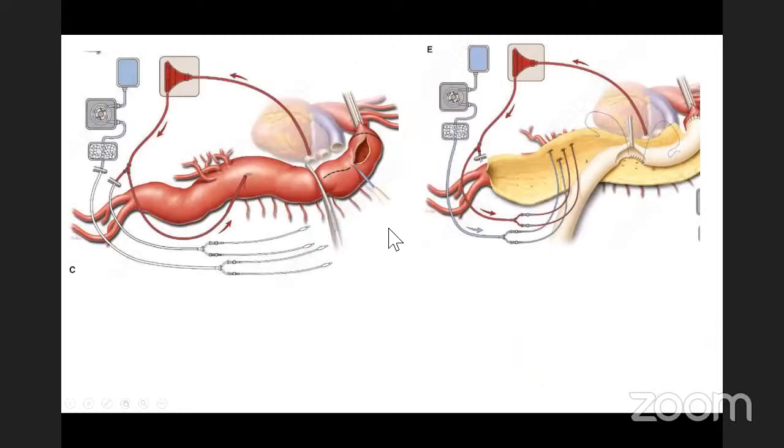This is another picture that I found in the book, in descending aortic surgery. Again, you clamp the aorta proximally, place your cannula in the pulmonary vein, I think, in this picture, and then you place the other part through the centrifugal pump to the distal part, and you do your surgery. Here it is the same while they are grafting the descending aorta, which, to be honest, is rarely used, especially now that TEVAR is replacing descending aortic surgery. So that's why I think it has rarely been used.